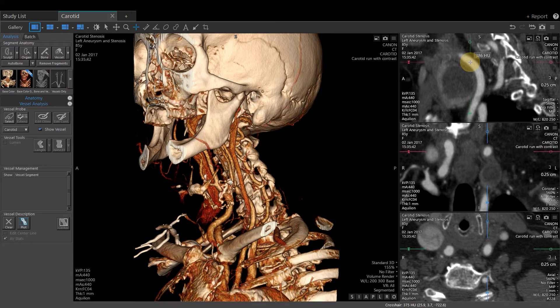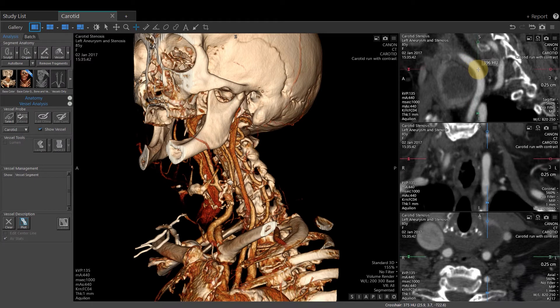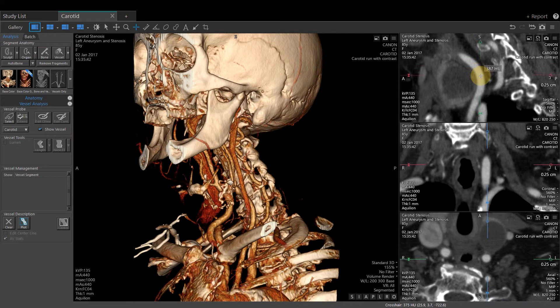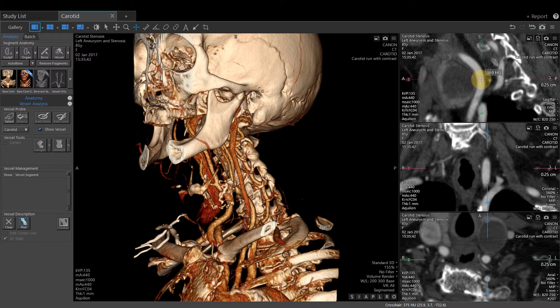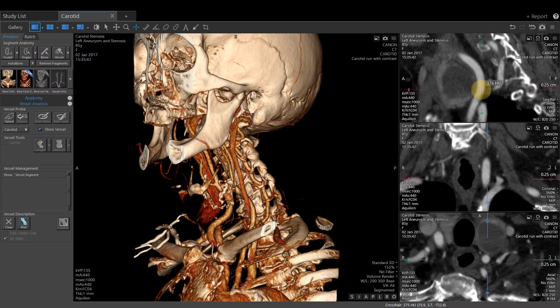Note that the Hounsfield units will be displayed to the upper right of the crosshair. Click and drag, and the units will be displayed on the different pixels.